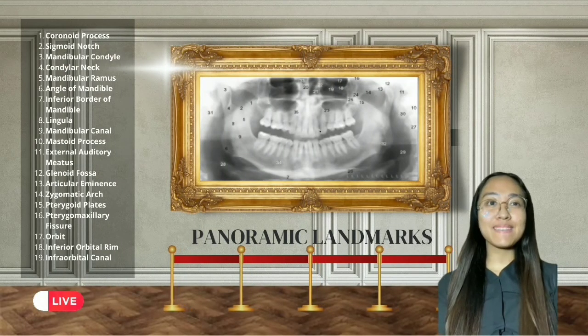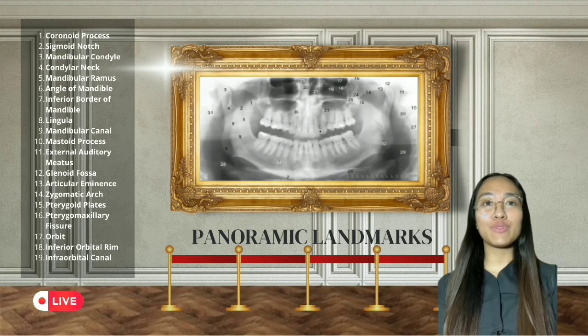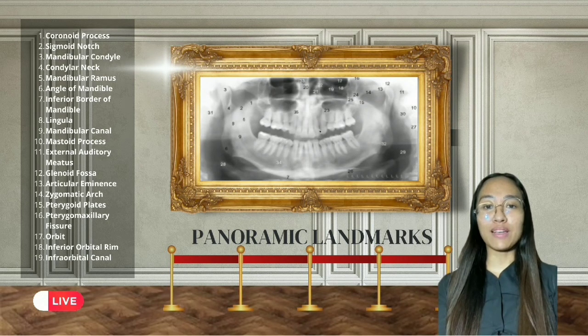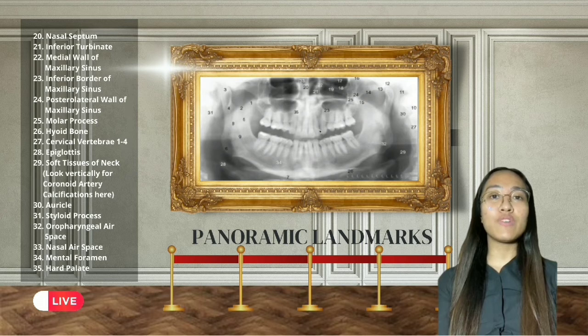And for the last piece that I'm going to be showing you, here is a photograph of a panoramic radiograph showing its landmarks. According to this radiograph, there are a total of 35 landmarks labeled by numbers. It is important to understand the landmarks normally seen on panoramic images in order to prevent misdiagnosis of a radiopaque or radiolucent area.